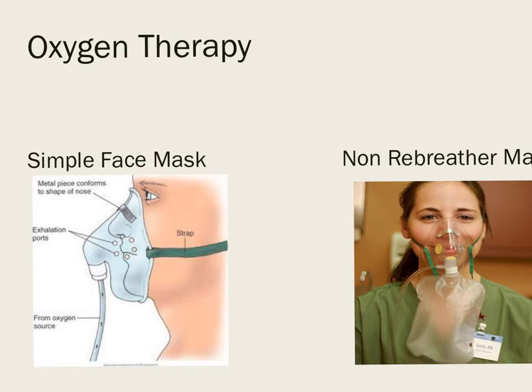The non-rebreather is considered also a low-flow oxygen, though it can deliver a high percent. The main thing I want you guys to understand is this is the bag, and this bag must first be filled prior to placing it on the patient's face. Okay, so we fill this, and then once we've filled this, then we can place the mask on the patient's face. Depending upon how much oxygen you want to deliver will depend upon how many liters you set this at.